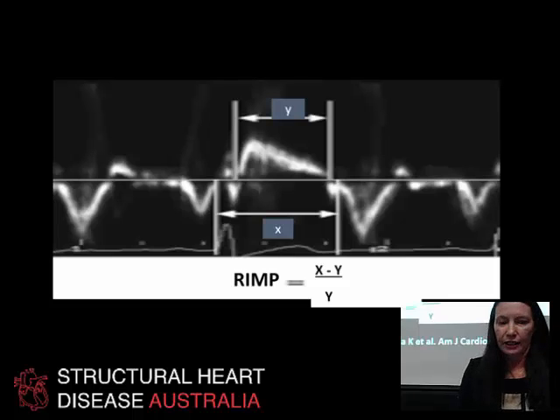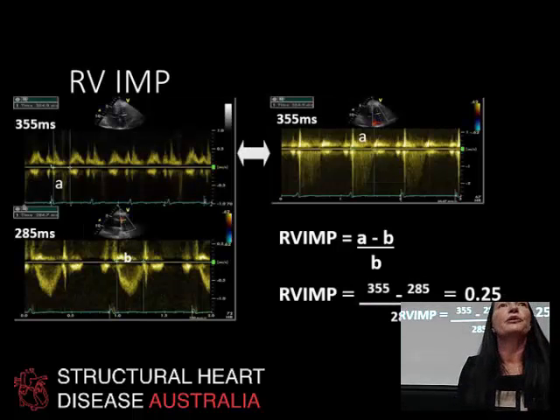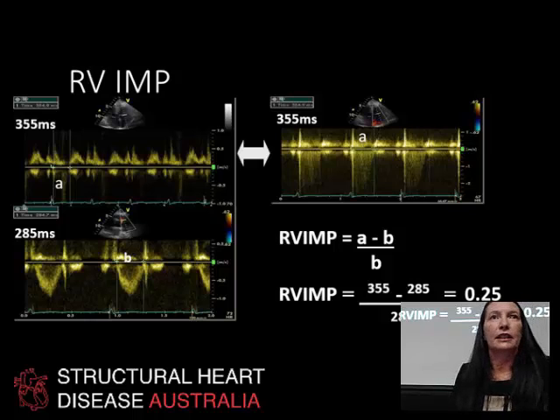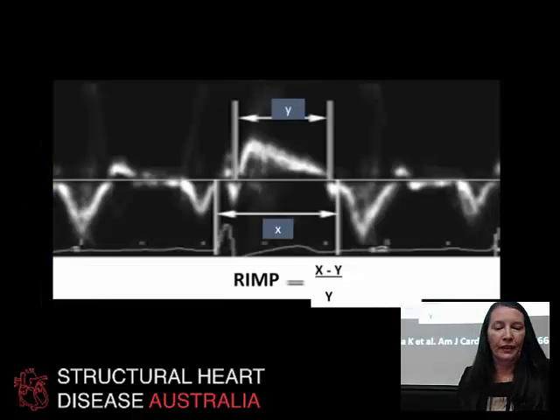Can also be, unfortunately with this one you need 2 cycles and they might be slightly different heart rates. So this is important if you're doing this measurement to make sure that you've got a solid heart rate and not much variation between these 2 captures.